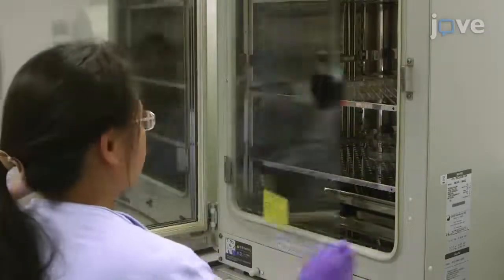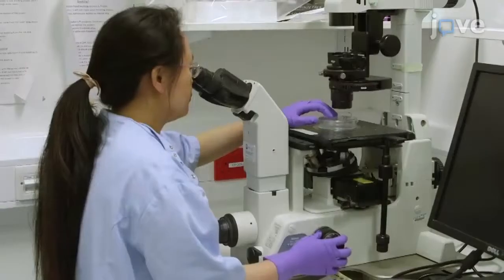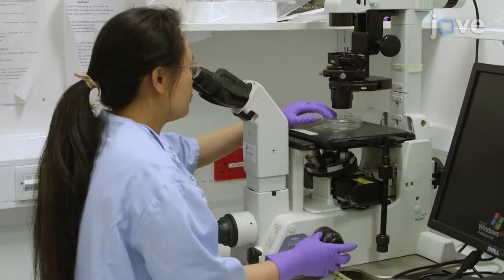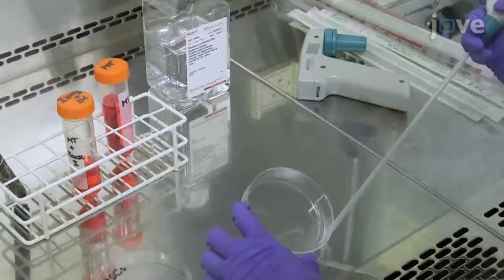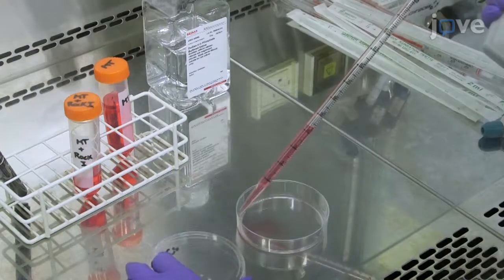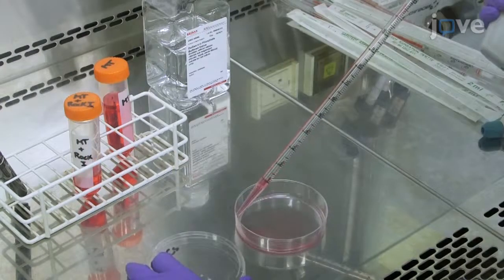Observe cell detachment under a microscope and extend the incubation for an extra 1 or 2 minutes if required. Stop the reaction by removing the cell dissociation reagent and adding 5 milliliters of fresh mTeSR1 medium supplemented with 10 micromolar ROCK inhibitor Y27.